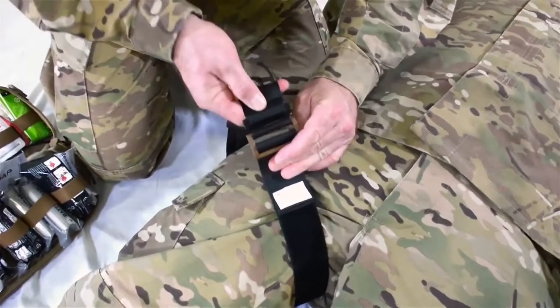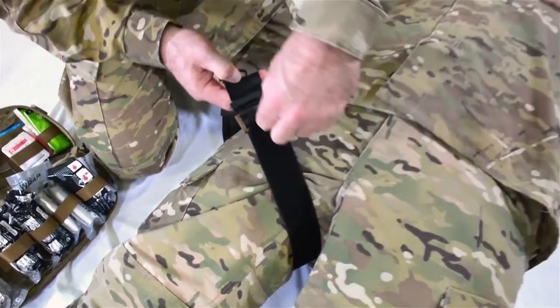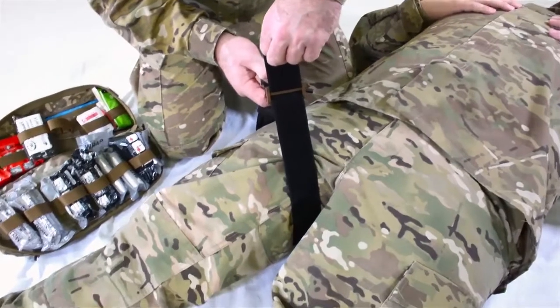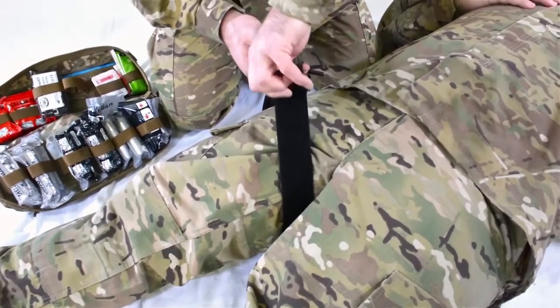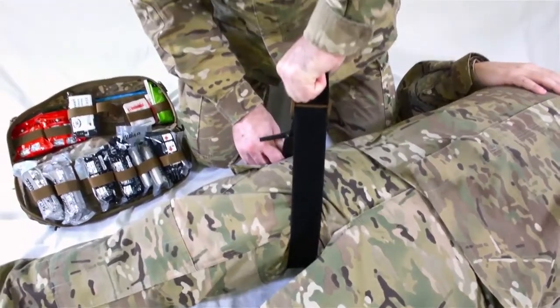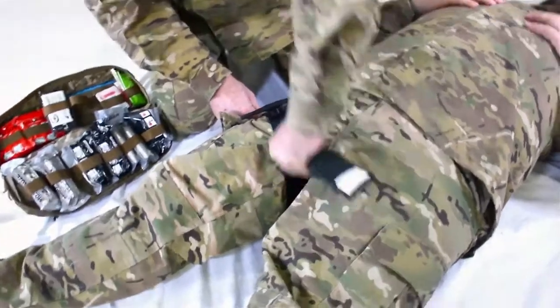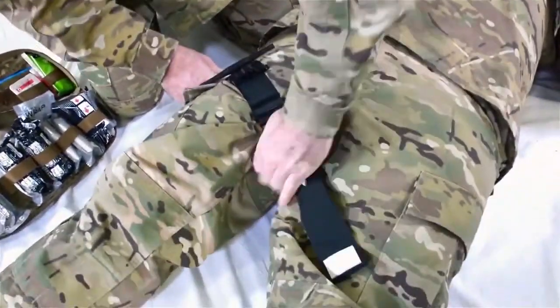Reconnect the buckle. Pull the time tab until the velcro tail is separated from the TMT. Grip the tail close to the buckle. Firmly pull up, out and away from the body and then downward in a quick ratcheting motion. Repeat this step until the tourniquet is snug around the extremity.